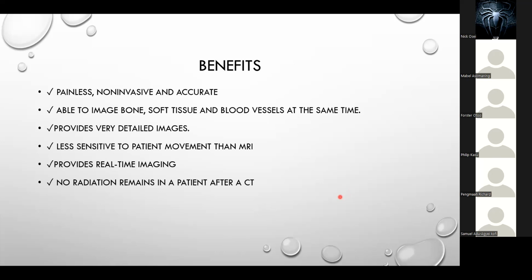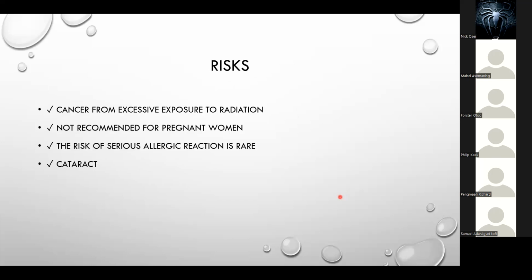So what are the risks? Of course, with radiation there's always a small risk that the patient might get cancer. It's also not recommended for pregnant women. If you must do it, then you need to use shielding. It's also not very common to get a serious allergic reaction, and it is known to sometimes cause cataract.